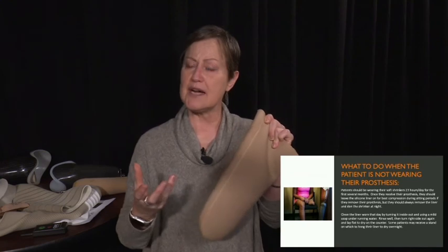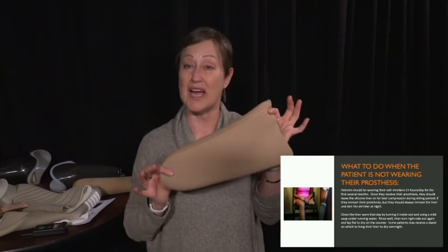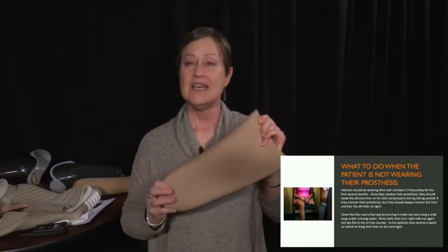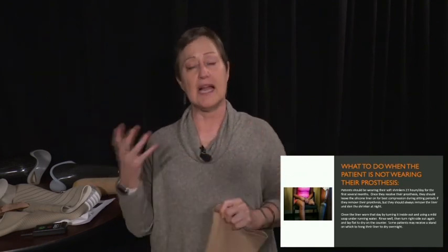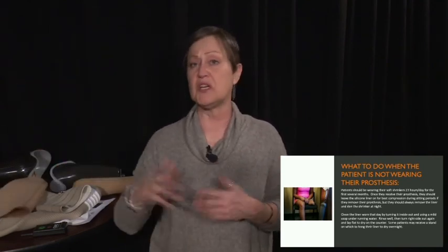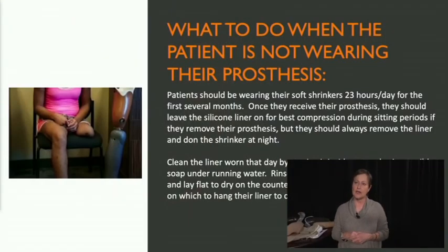If they're early in the process where they're wearing their leg a couple hours, then taking it off, putting it back on during the day, they can leave their liners on, maintaining the size of their leg. This is great shrinking right here. But at night, they always take it all off and they put on their soft shrinker. That's what they should be doing at night. Some people years out from their amputation still wear a shrinker at night because it gives them a sense of security. What you don't want is that they're not wearing a shrinker at night. If they swell up in the middle of the night, which can happen for amputees depending on other medical conditions, then they can't get in their socket in the morning, and that's not cool.